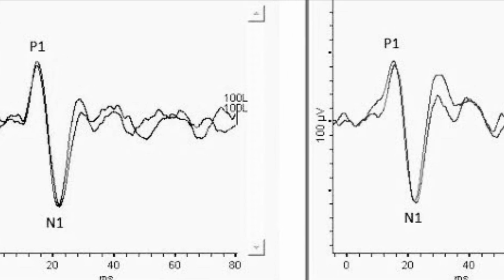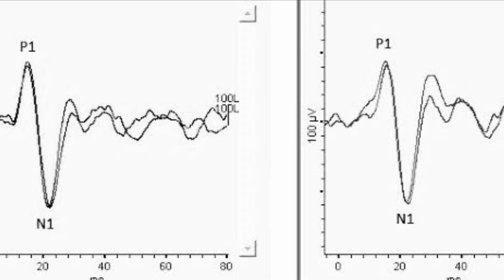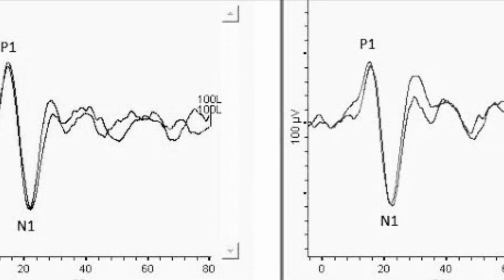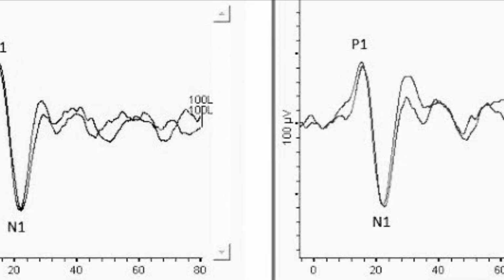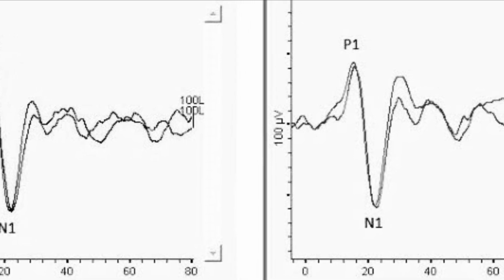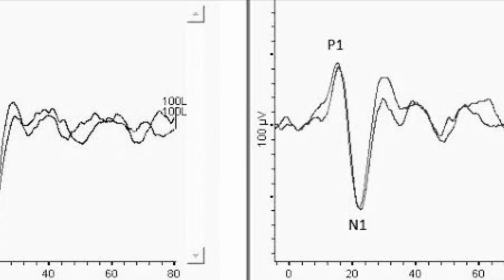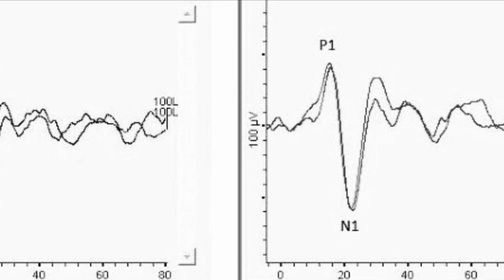From here, motor signals are sent down the medial vestibulospinal tract, activating the sternocleidomastoid muscle. The response is measured using electrodes placed over the sternocleidomastoid muscle. This reflex helps us assess saccular function and the integrity of the inferior vestibular nerve.